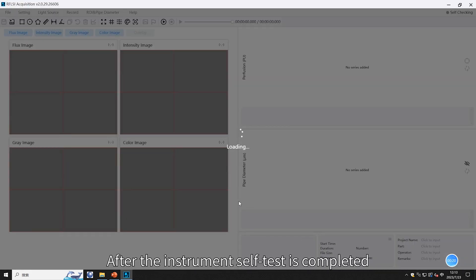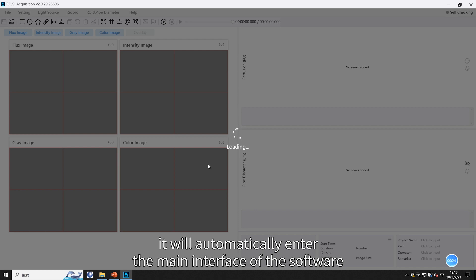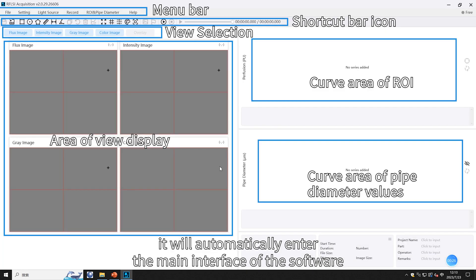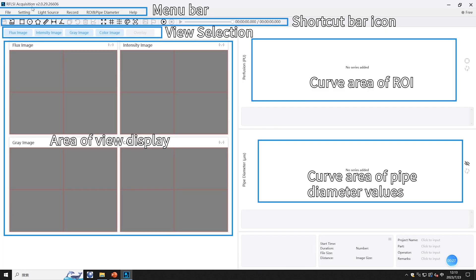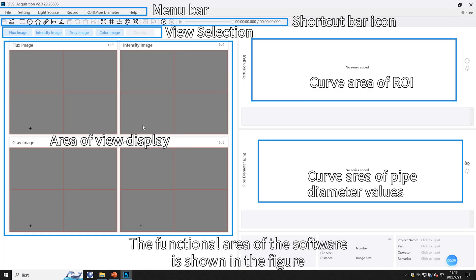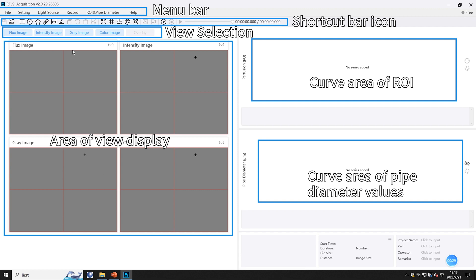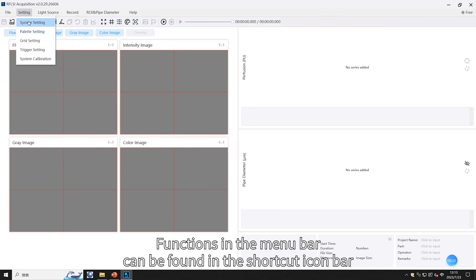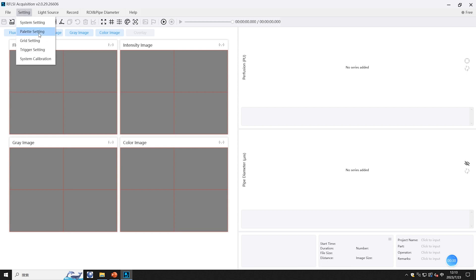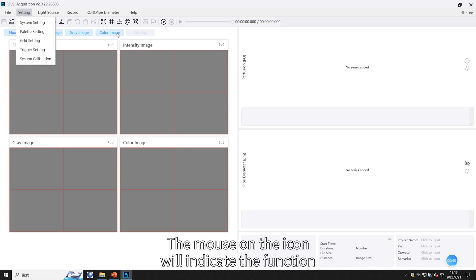After the instrument's self-test is completed, it will automatically enter the main interface of the software. The functional area of the software is shown in the figure. Functions in the menu bar can also be found in the shortcut icon bar; hovering the mouse over an icon will indicate its function.